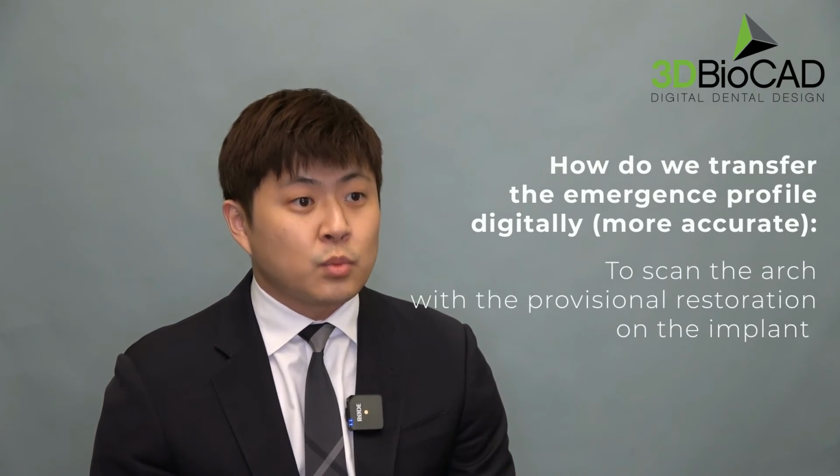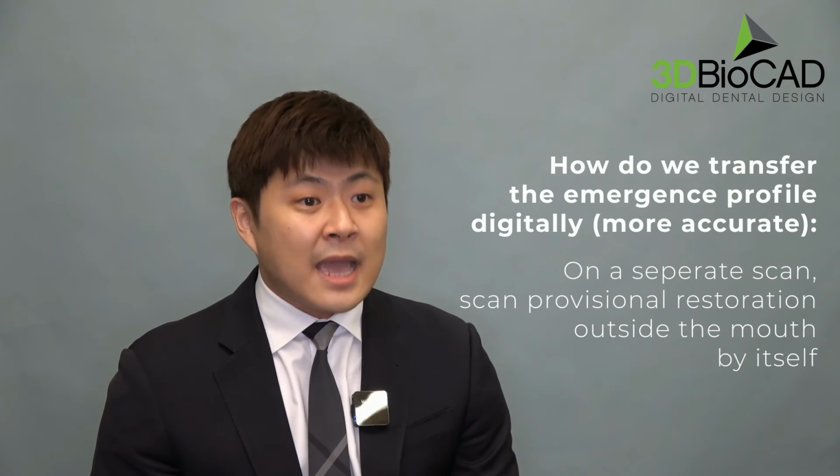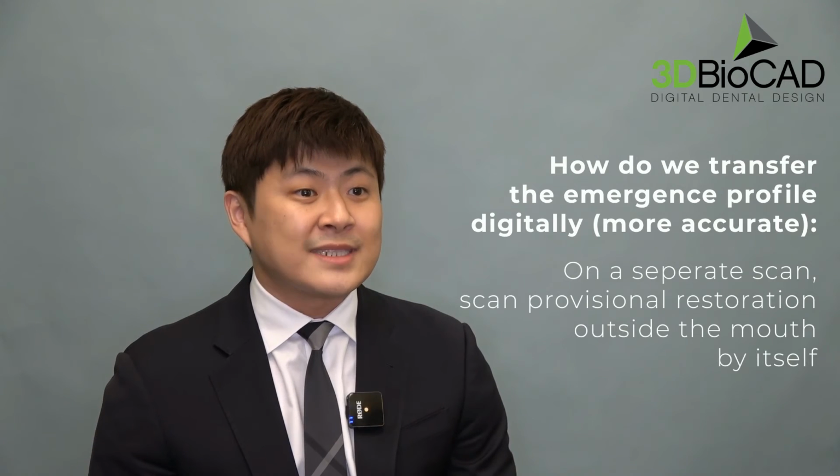So a more predictable and more accurate way of transferring the emergence profile of the provisional is to scan the arch with the provisional restoration on the implant. And on a separate scan, you scan the provisional restoration outside the mouth by itself. Then the lab will be able to superimpose these scans, and this way we have successfully transferred the emergence profile of the provisional restoration to the lab.